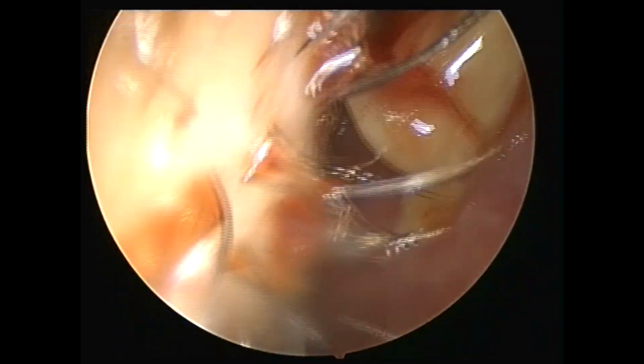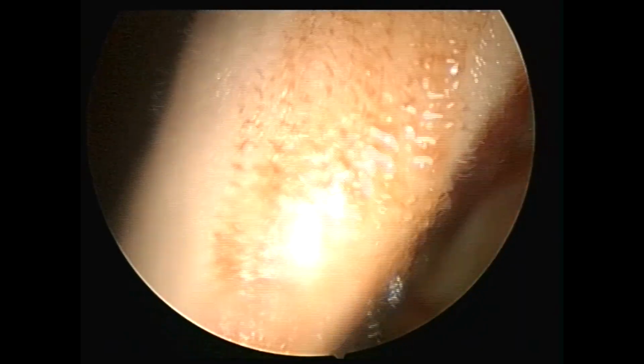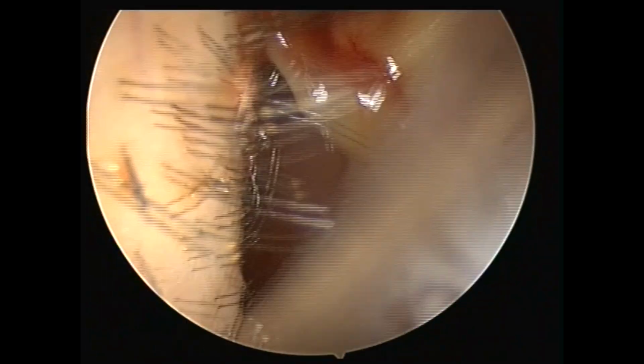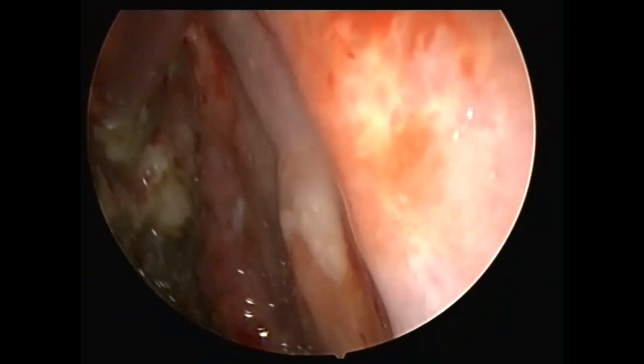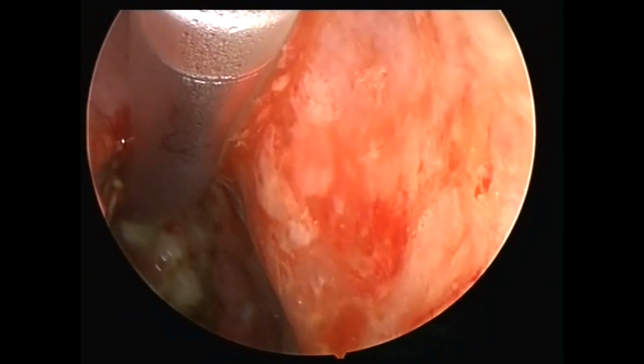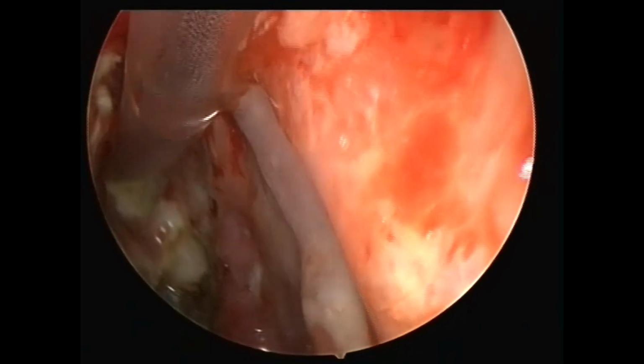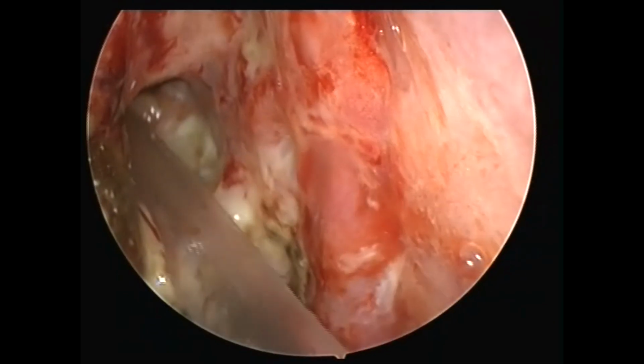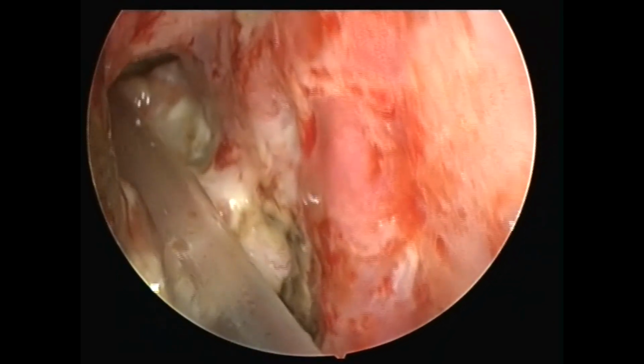So take your 70-degree endoscope just the way I'm using it right now. You can see the three-way is arranged in such a way that the irrigation is going to go directly through the tube. So you just have to insert that tube inside and it's going to take its own course. As you go, the natural curve of the tube is directly going to make the tube go inside the frontal sinus. Can you see that? How beautifully it just entered directly in the frontal sinus without any hesitation.